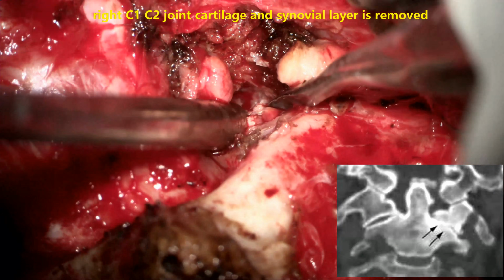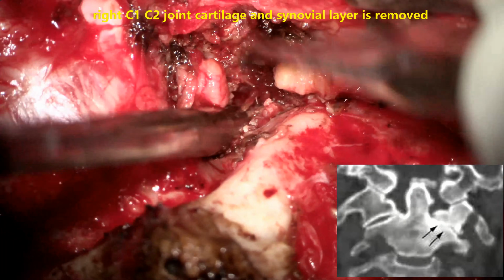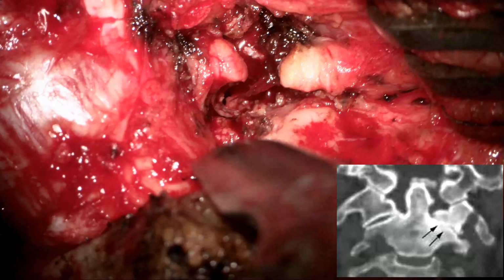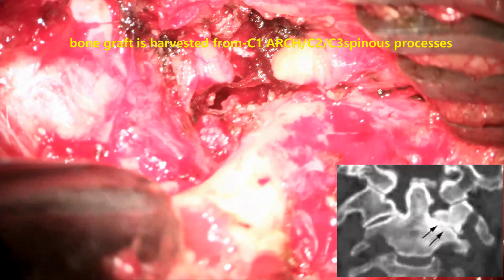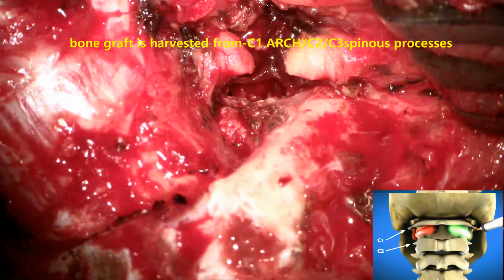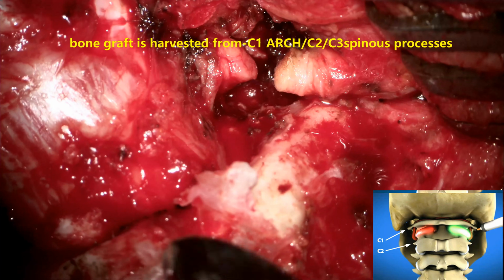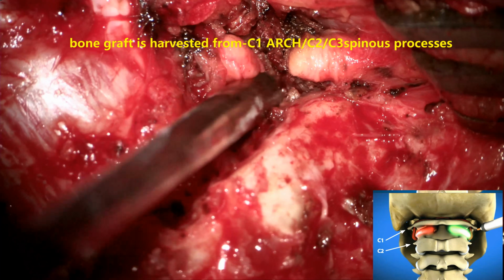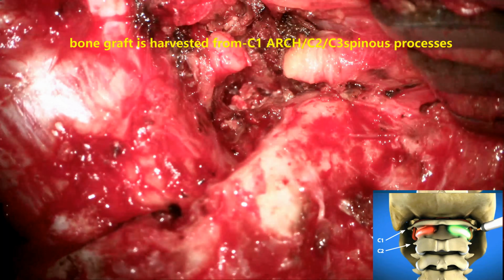The cartilage and the synovial contents of the joint space are removed, and we take out the C2 spinous process and laminae of C2 and the spinous process of C3. These are used as the bone graft. Here, the cortical and cancellous bone is very good.